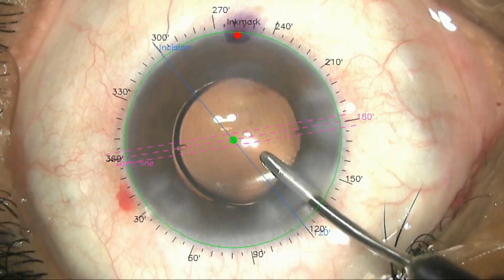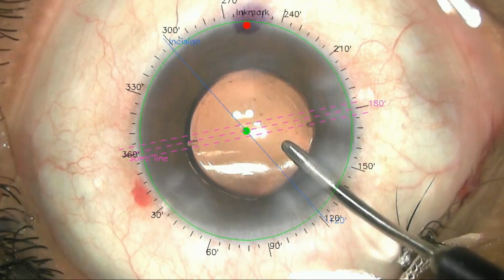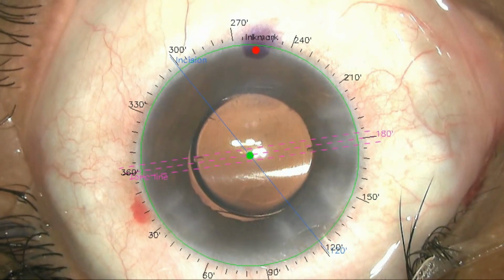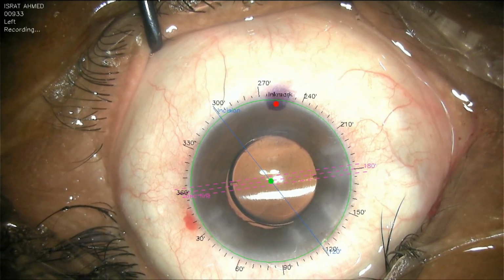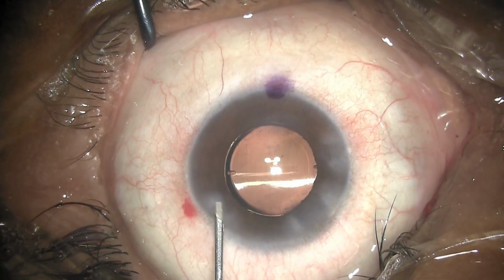I'm just going to once again gently nudge the IOL into place. And now once this is done, I'll put off the guidance and switch back to my other HDMI mode. And you can see the IOL is well aligned and the surgery is completed with hydration of the wounds.